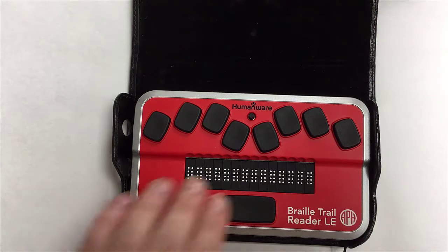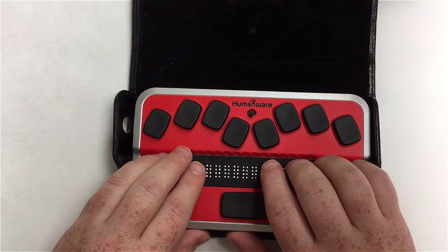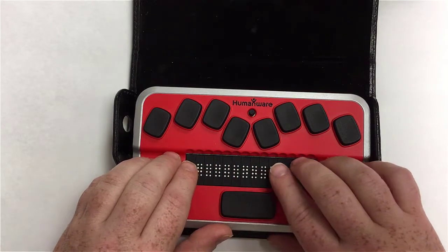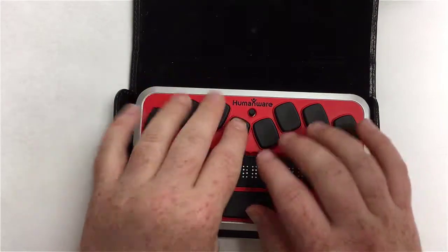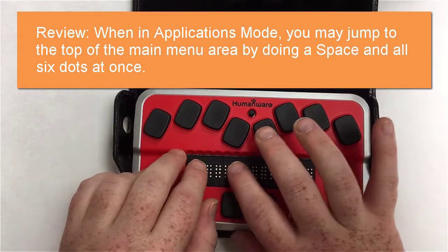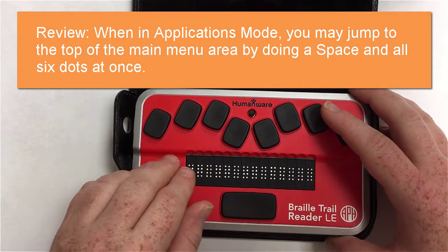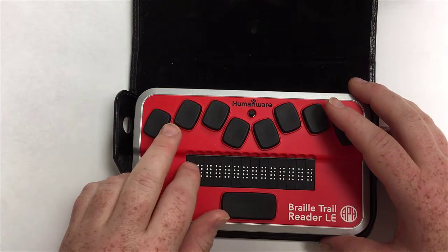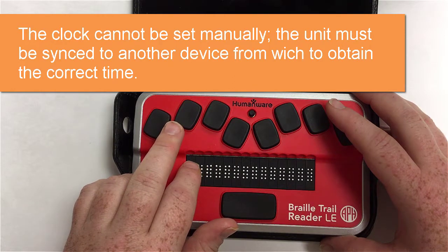The unit had fallen asleep, so I pressed my inner thumb keys just to wake it up. Since I wasn't sure exactly where I was, I did the chord with full cell — space with one, two, three, four, five, six — and now I'm at the clock for sure. I can navigate menus using the previous and next thumb keys. The first menu item is the clock, and the second is notes.